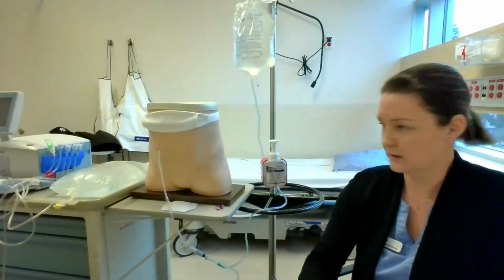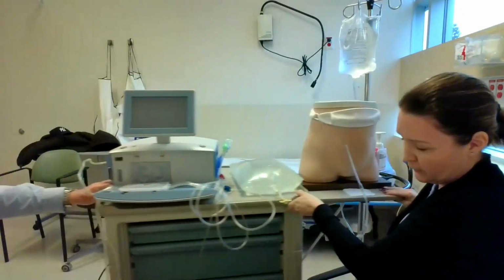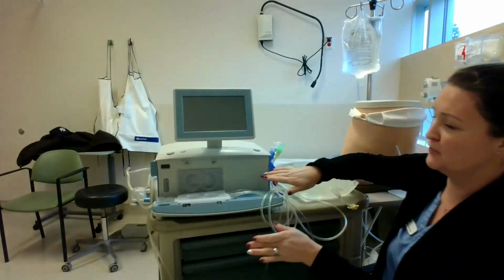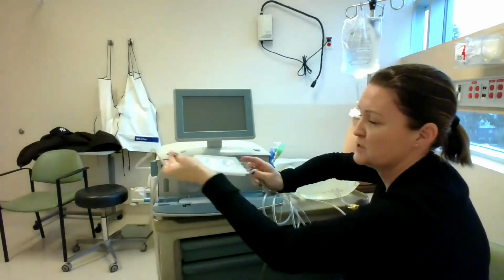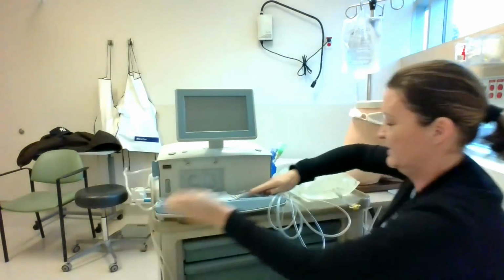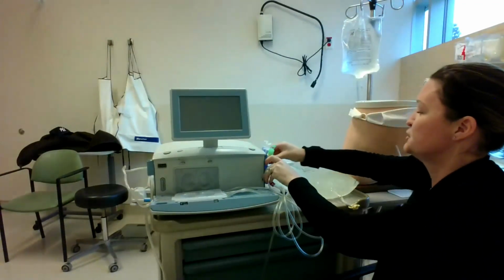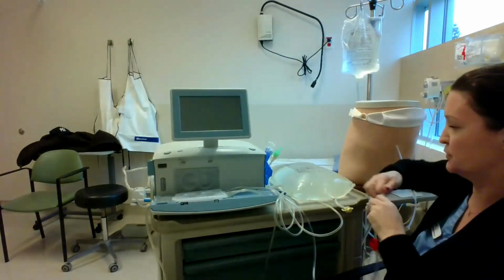Now I'm going to show you the cycler, or automated PD. So we have our cycler machine, and it's pretty user-friendly. Basically, you'll have your cassettes, which can be removed and placed in the machine. And then you have your tubing on the side. And then the tubing gets connected to your 5-liter dialysate bag. And I'll just show you.